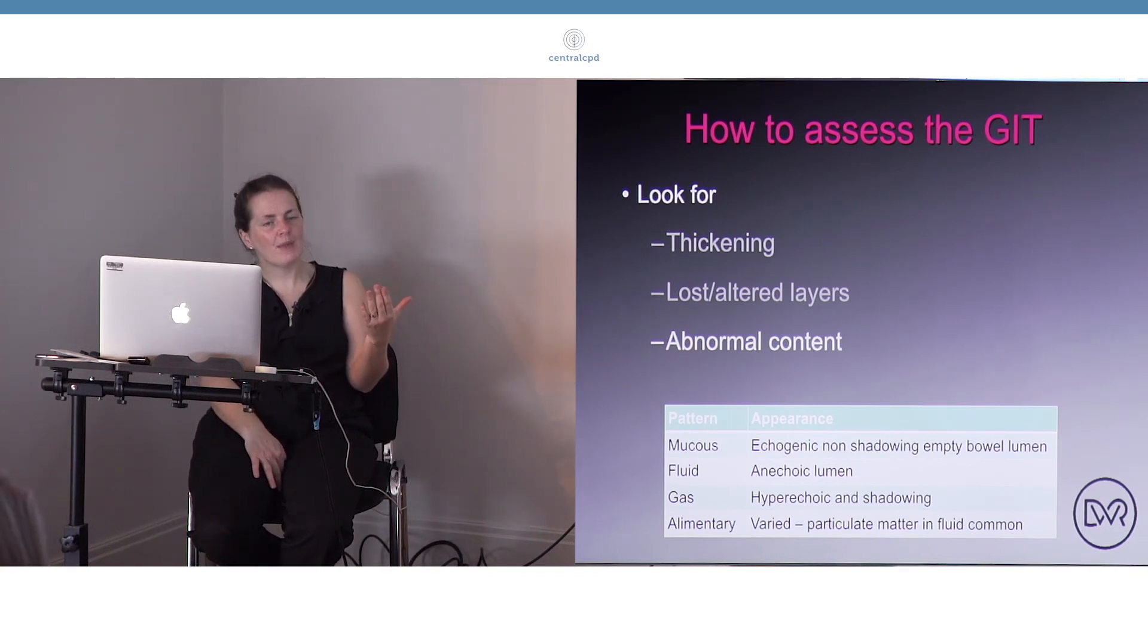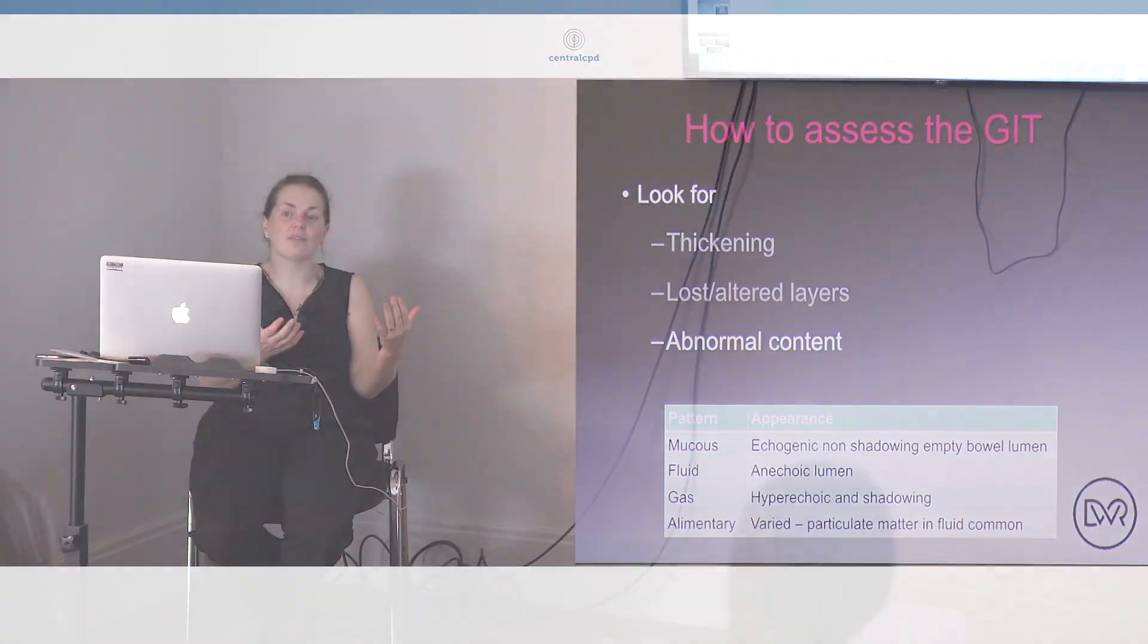If there's gas present, it will be hyperechoic and will have that dirty shadow. What I want to show you today when we see the patients is the whole variety of things we see when there is ingesta moving through.